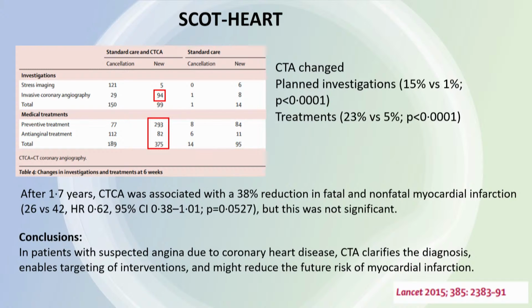But then their subsequent study, which is the next slide, is the 5-year outcomes of the SCOT-HEART trial. The conclusion from this one was that a strategy including CTA in addition to standard of care clarifies the diagnosis and enables targeting of interventions and initiation of treatments, and because of that, may lead to a reduction in the future risk of major adverse cardiac events.